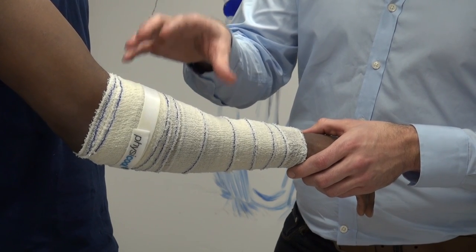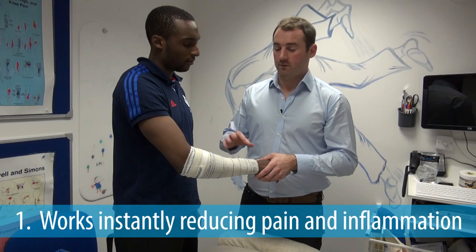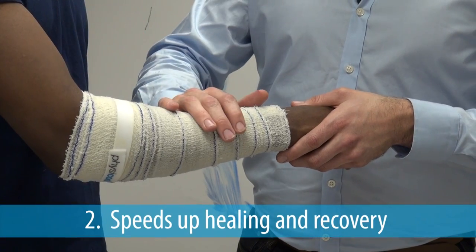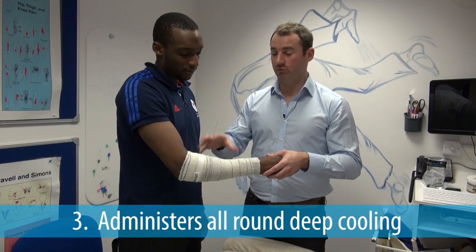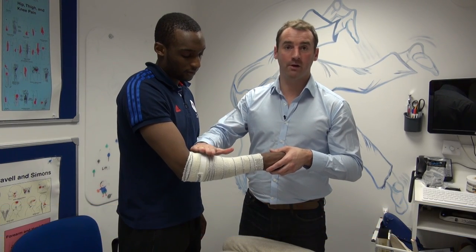Unlike ice, Physicool will drop the temperature of the limb slowly so as not to cause shock. Physicool works by rapid evaporation, pulling heat out opposed to trying to drive cold in, bringing blood to the area which helps speed up healing and recovery. The bandage gives 360 degrees conformity, giving all-round deep cooling opposed to applying ice to just one area of the limb.